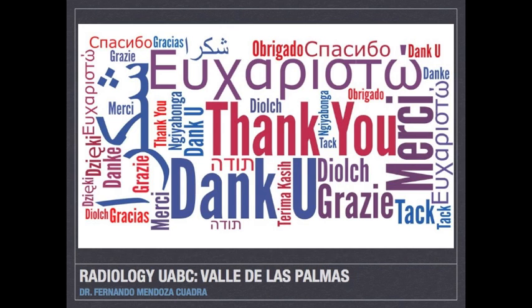This concludes the video, so now you know how to do an abdominal CT scan.